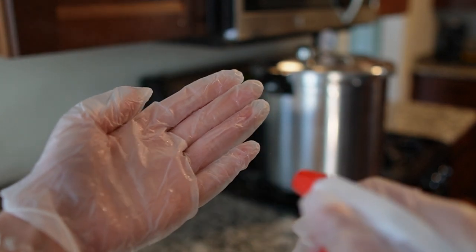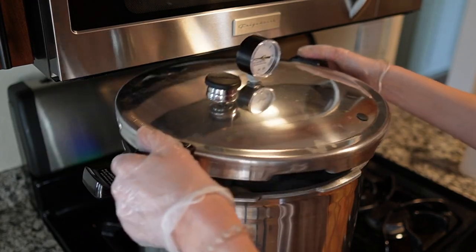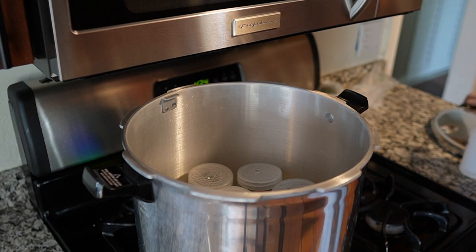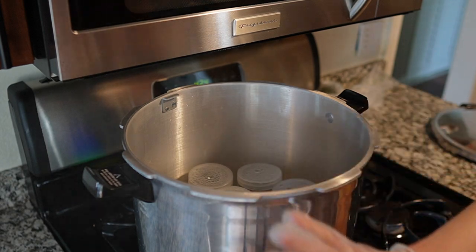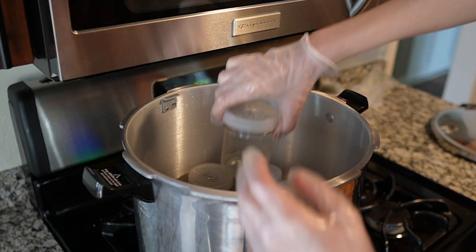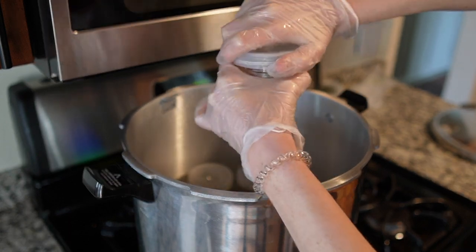I usually wait around four to six hours after autoclaving before opening the pressure cooker, as it stays hot for a very long time — be careful not to burn yourself. When you're ready to open it, wash your hands, put on gloves, and spray the gloves with 70% ethanol. You can also use isopropyl alcohol or a 10% bleach solution, but never mix alcohol and bleach. The tissue culture jars are sterile at this point, so carefully remove the lid and twist the lids onto the jars one by one, re-spraying your hands with alcohol every couple of jars.